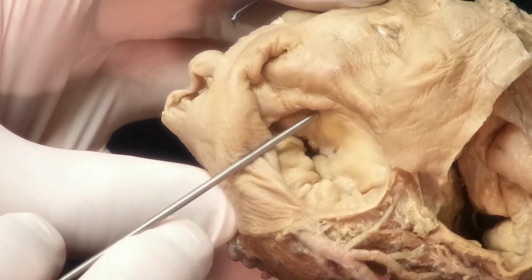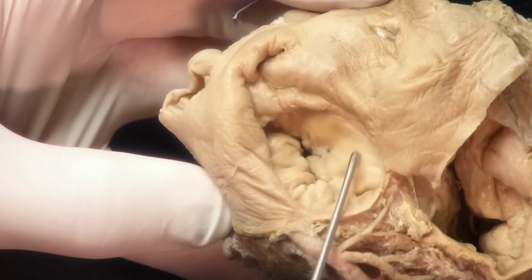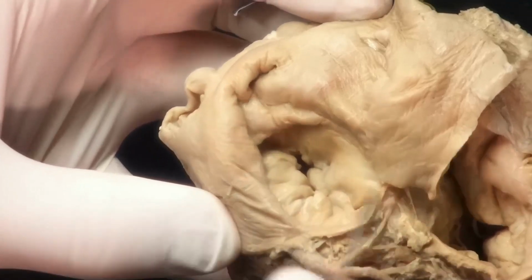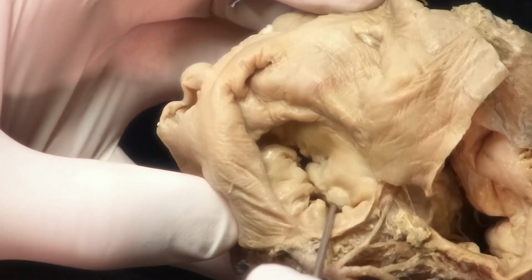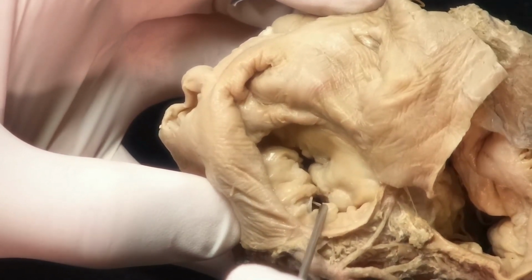And so we need to orient our clip in different ways depending on which area of the mitral valve we are clipping. So clearly, one main zone of apposition, there are multiple folds in the posterior leaflet in particular that allow the leaflets to come together, and we'll focus on one of these in just a moment.